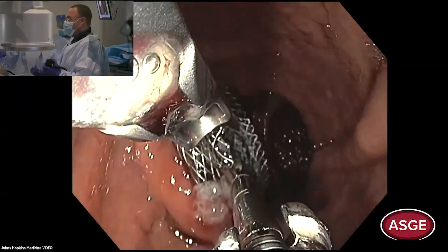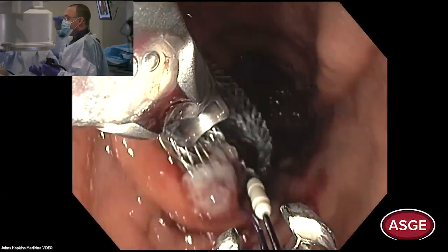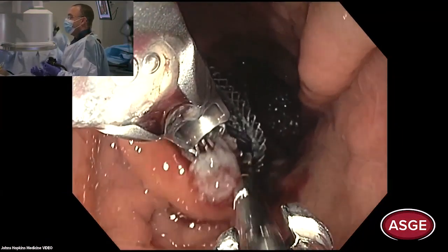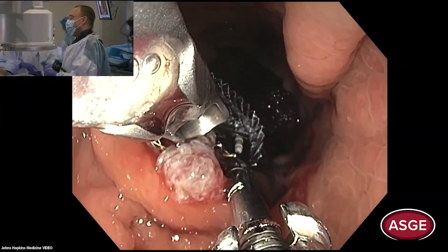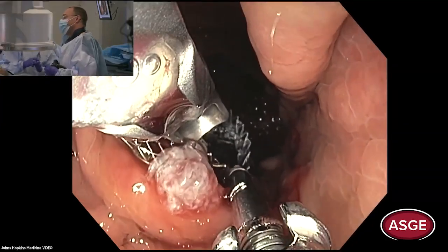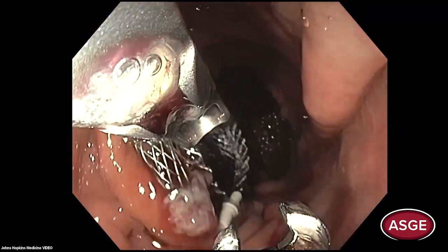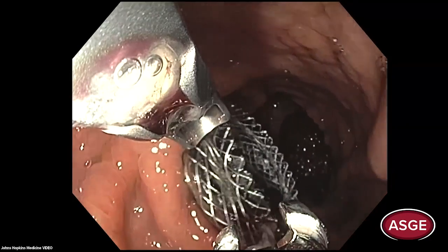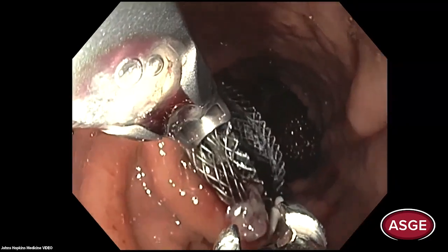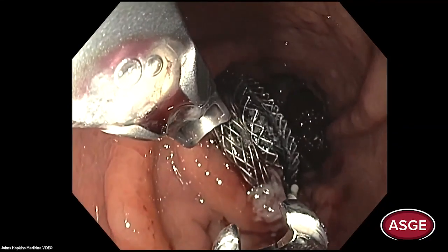The 20-millimeter AXIOS is already dilated. We put the first suture and I'm cinching it. I like to put two sutures just to reinforce it — it takes a few minutes — and then we'll be ready for the ERCP.